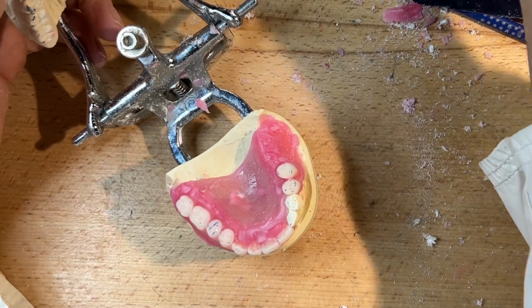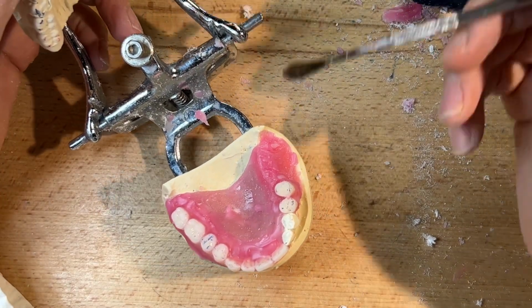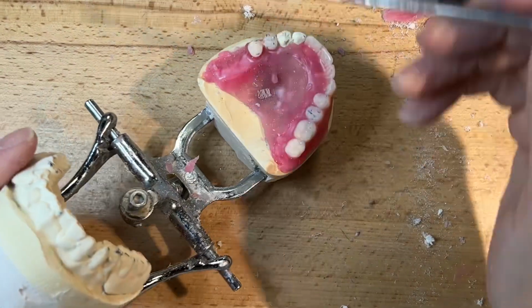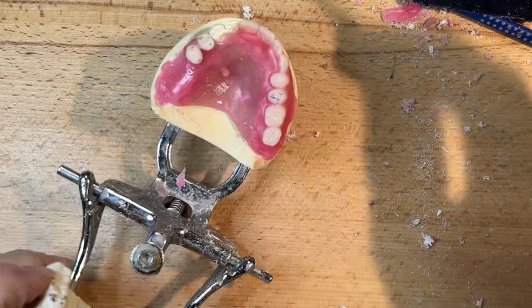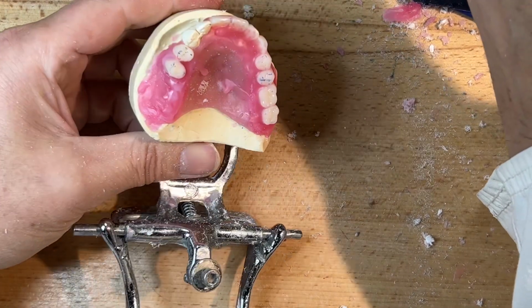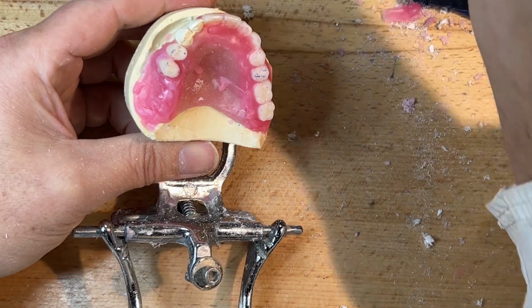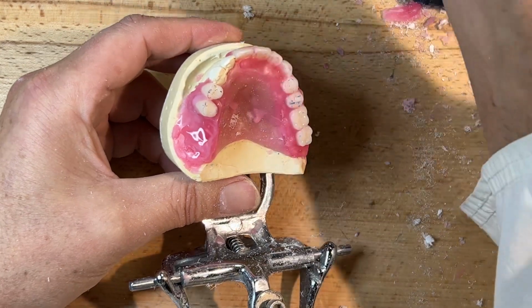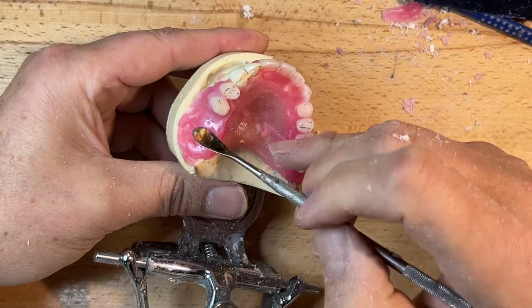Will I reduce all of them? I'm hoping, but I know for one thing for sure, I'll be minimizing anything. And I find that is overlooked a lot in some of the cases that come across the lab bench, wherever around the planet the dentures are made.